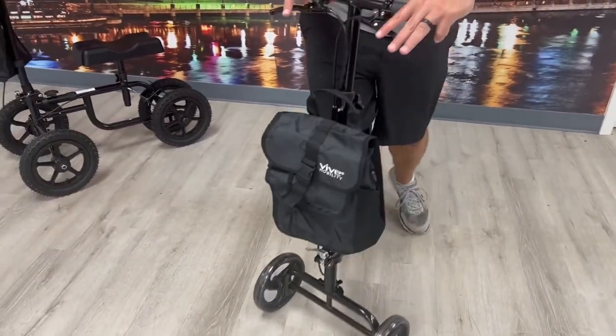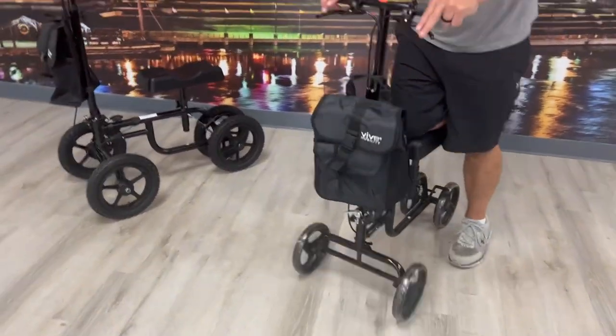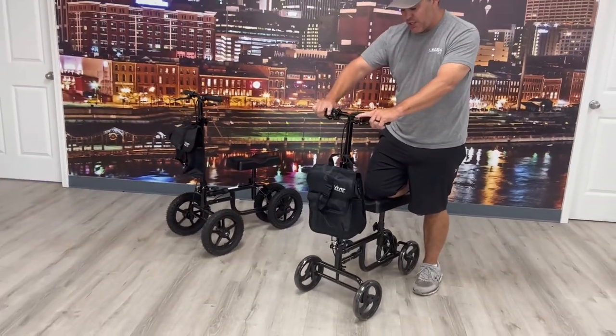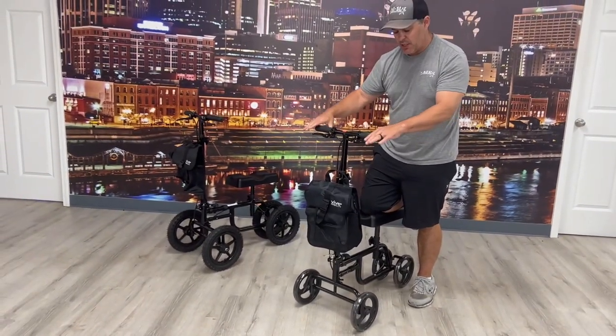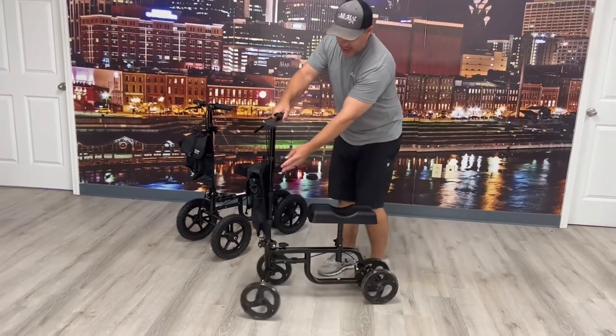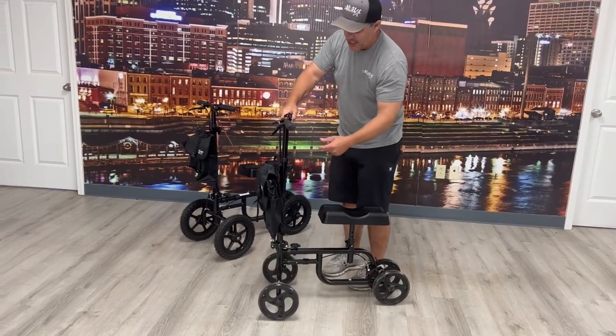They all have a pretty good turning radius. They have wheel locks up here — you just squeeze to lock them in place, and to unlock them you just release. You can also adjust the handle height right here with an easy knob.